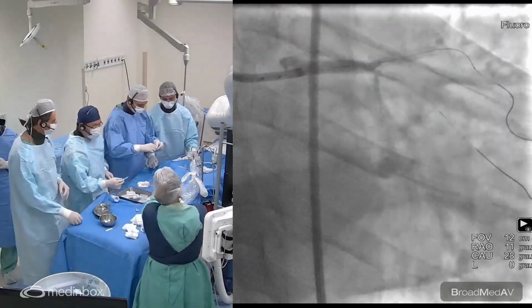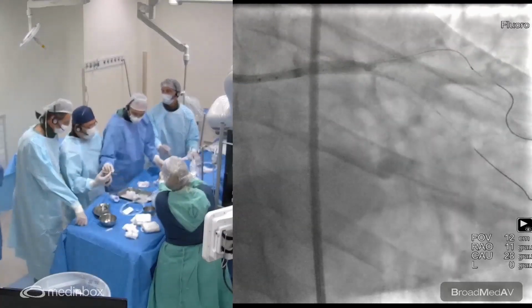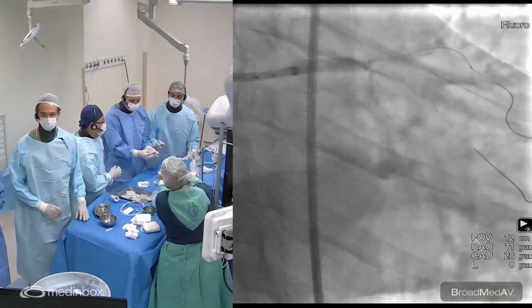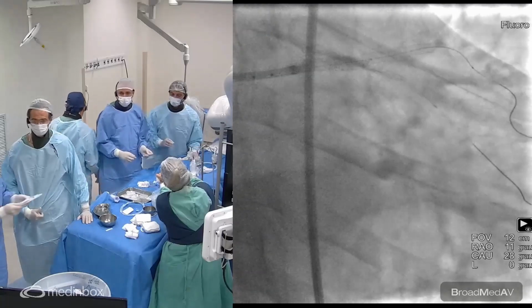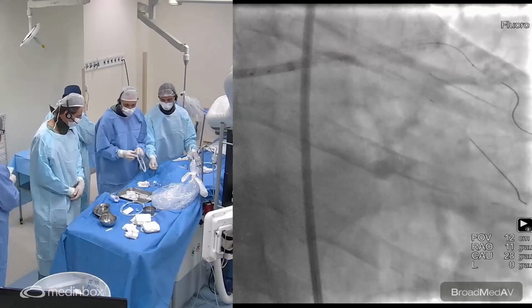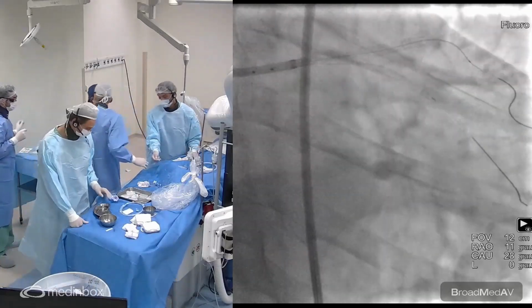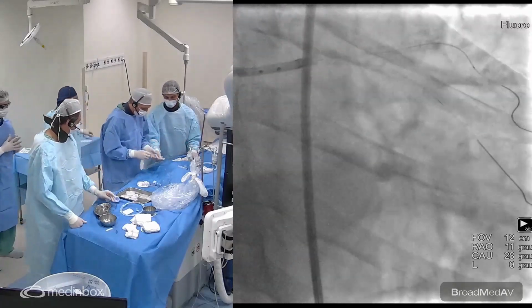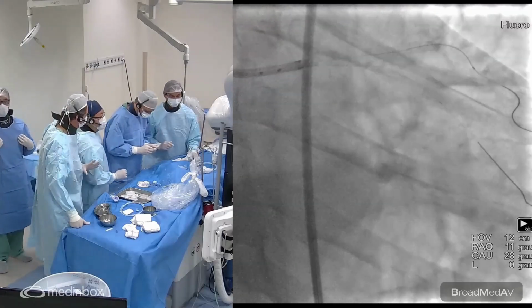To recross the guide wire, we are going to recross the circumflex. Yes, and the balloon. So, what did you decide now, Ricardo? So now, Rodolfo wants to post-dilate the ostium of the LAD. The ostium of the LAD is clearly underexpanded, and then we're going to recross with the wire into the circumflex and do the final kissing. So first we are going to open the proximal LAD.